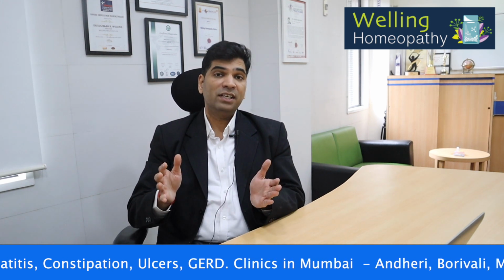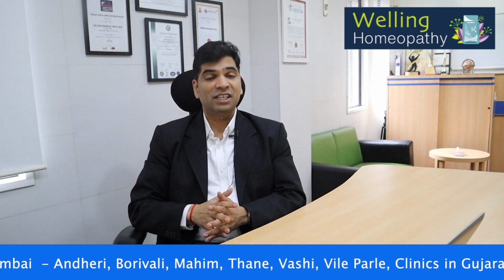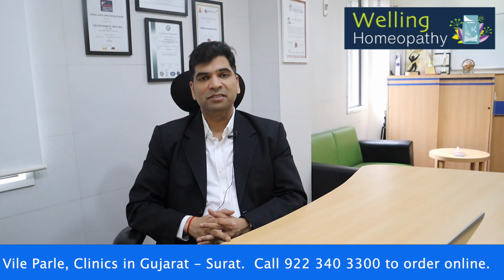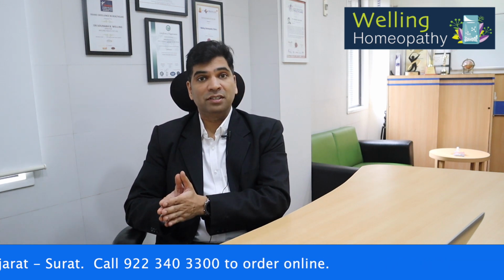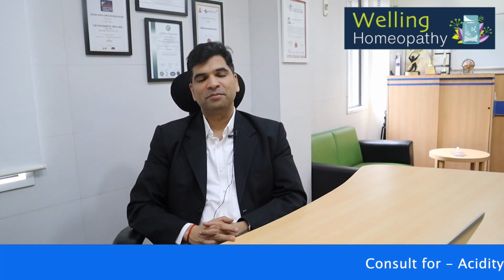Now, one big advantage of ovulation kits, unlike your basal temperature charting, is that they tell you when you're going to ovulate, or when the ovulation is approaching, not that it has already passed. Unless you're also checking your cervical mucus, a chart cannot tell you when you should have sex.